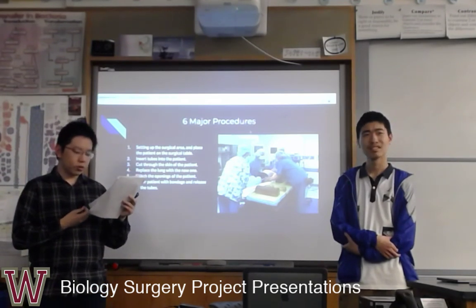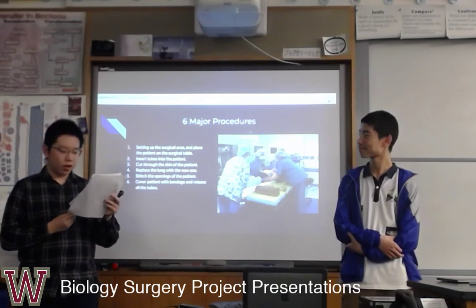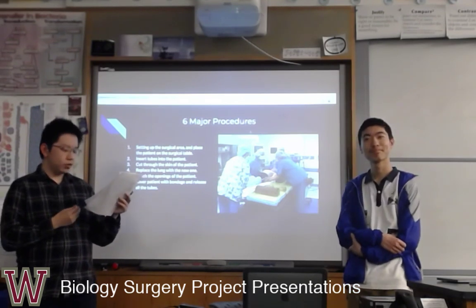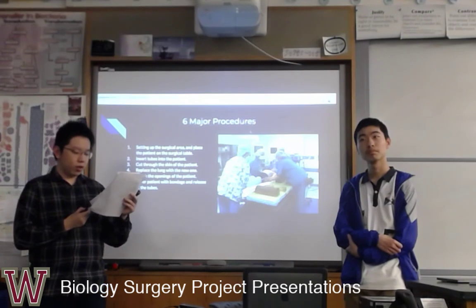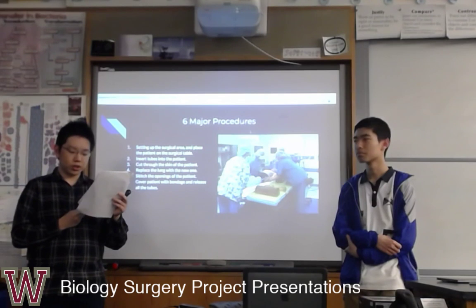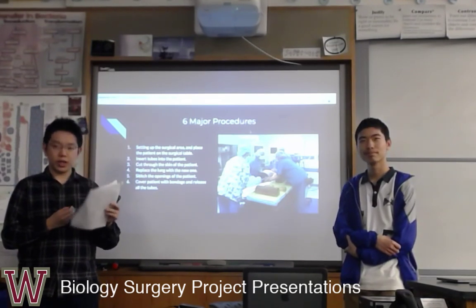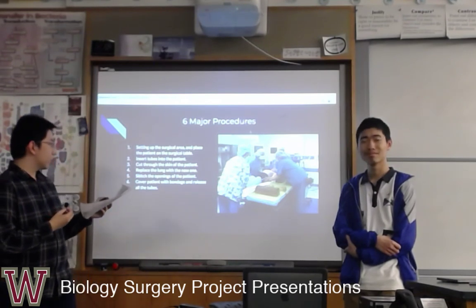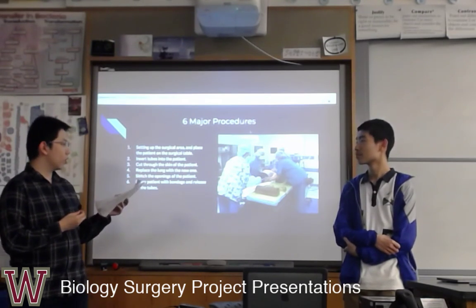After we replace the donor's lung, we should carefully release the retractor on the chest and use surgical sutures to stitch the inside skin together. And use bandages to cover the incision of the patient's skin to prevent infections and potential harms. And after that, we can just release all the tubes from the patient, and the whole surgery is done.